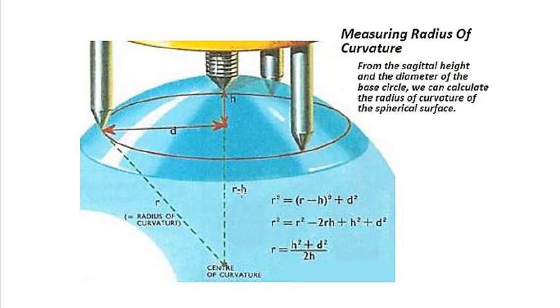The rest of it is easy because it forms a right triangle, because the 90 degrees is right here. So that's your base, which is d, your hypotenuse is your r, and r minus h is your adjacent.